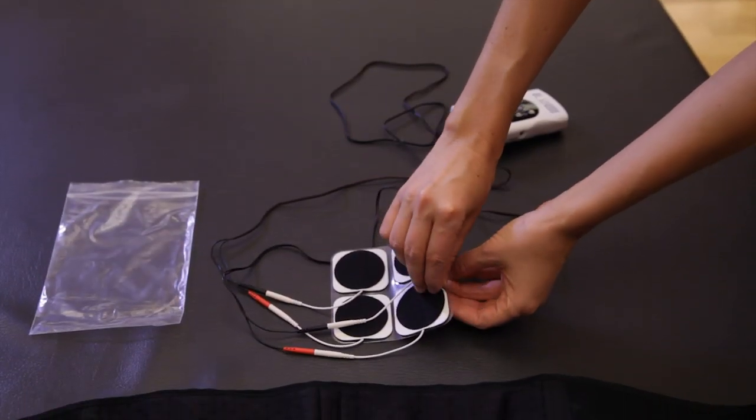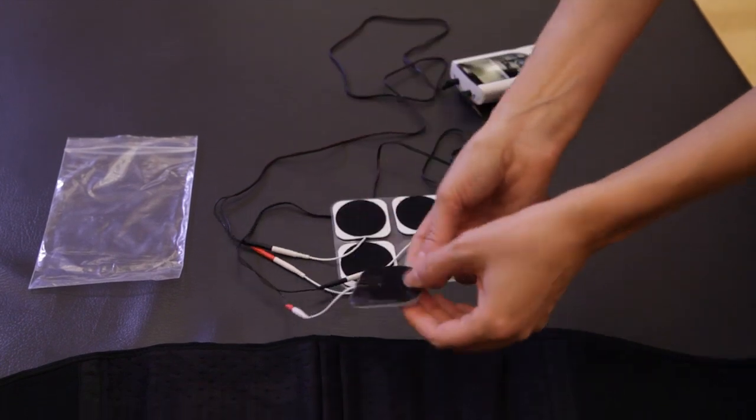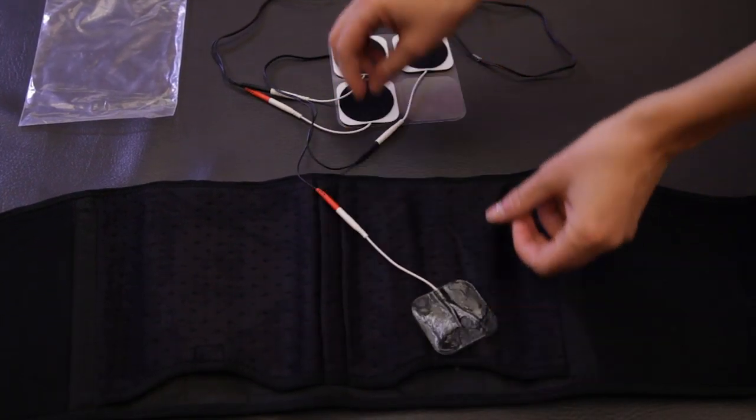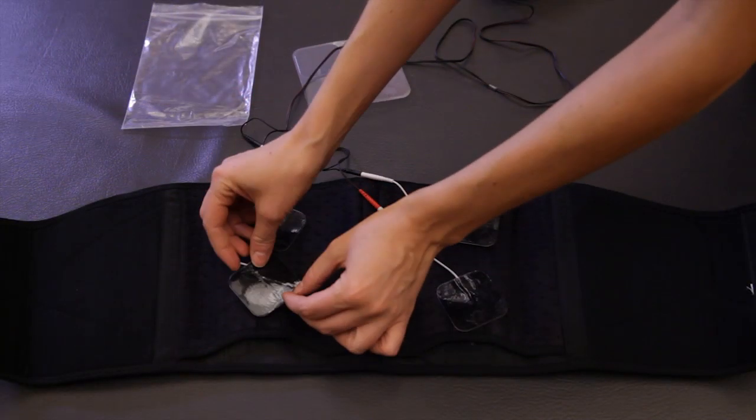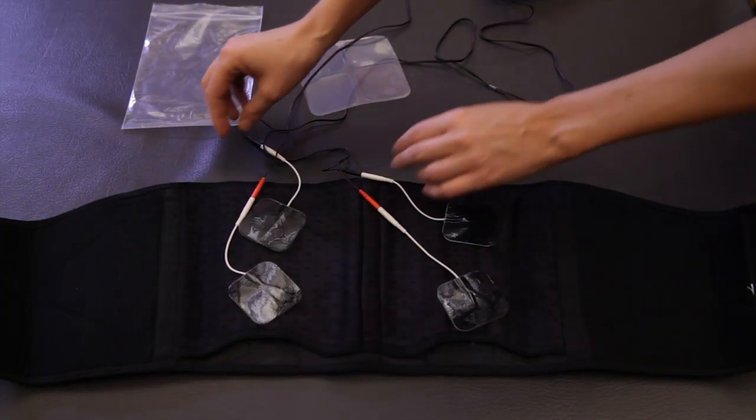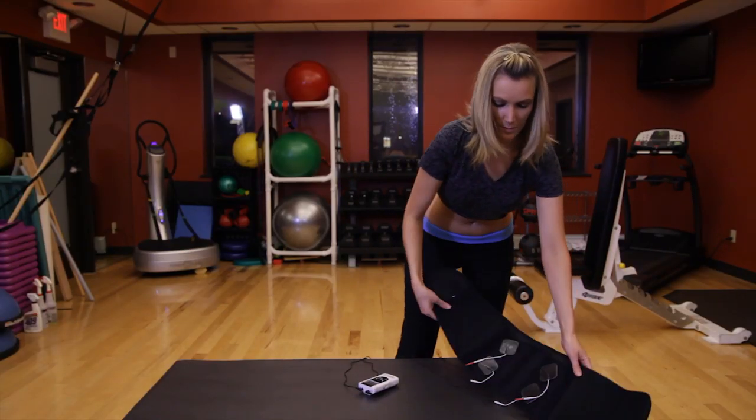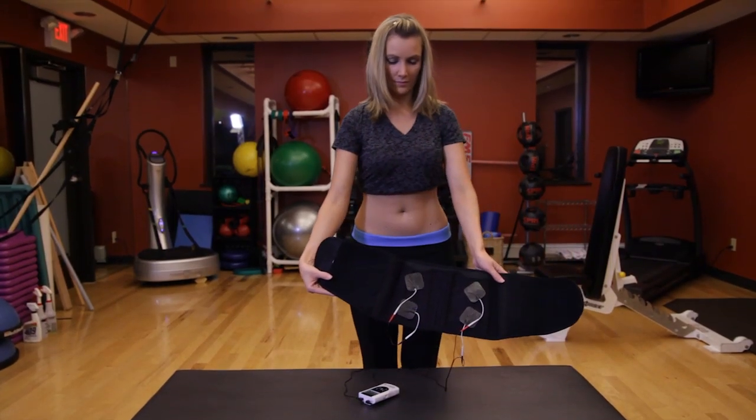Place the Velcro side of the electrode onto the garment with the sticky side of the electrode facing up. Position the back garment around the waist with enough tension to assure a proper fit.